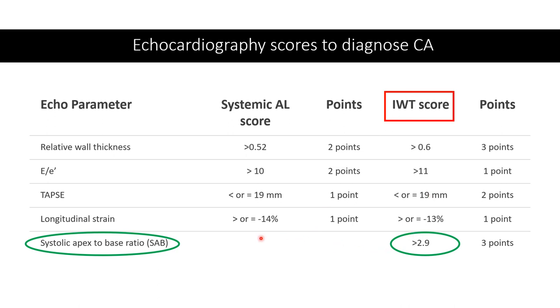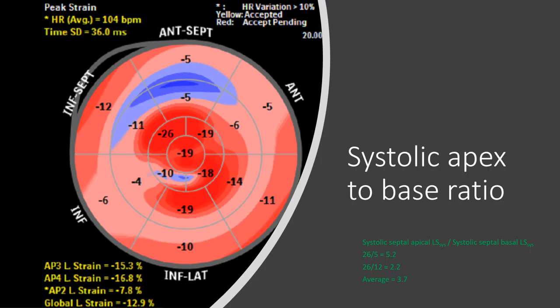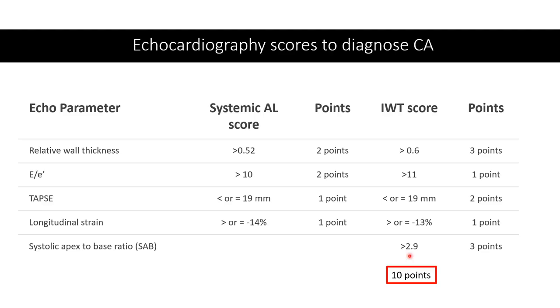The last step in the IWT score is to calculate the systolic apex-to-base ratio — if it's more than 2.9, you get three points. This ratio is calculated by dividing the septal apical systolic strain by the septal basal systolic strain. We took an average and it was 3.7, which is more than 2.9, again reproducing the characteristic feature of apical sparing in cardiac amyloidosis.